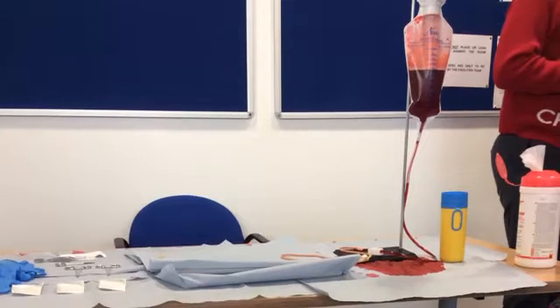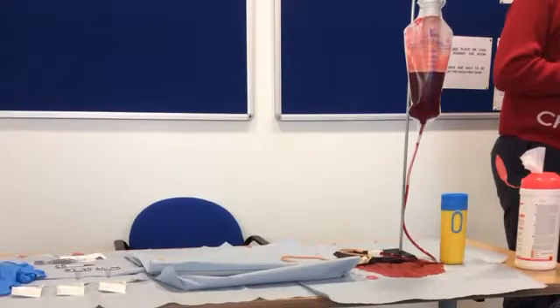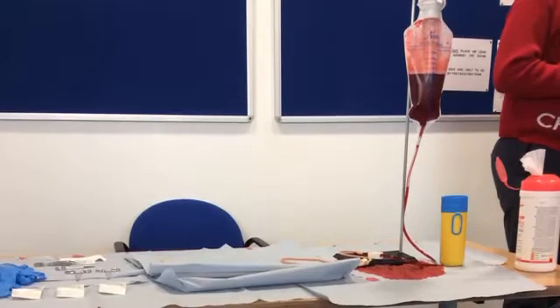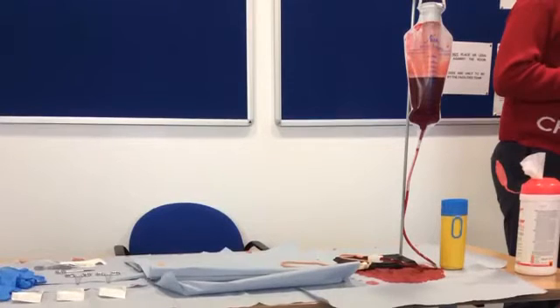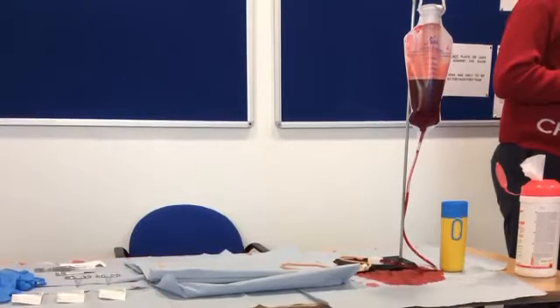In order to perform this skill, you will need to set up the following: an IV bag with fake blood, as shown in the photo. Then you will need to attach an artificial blood vessel to the IV line with an IV line stopper to control blood flow. All of this equipment is readily available in the Clinical Skills Resource Centre.